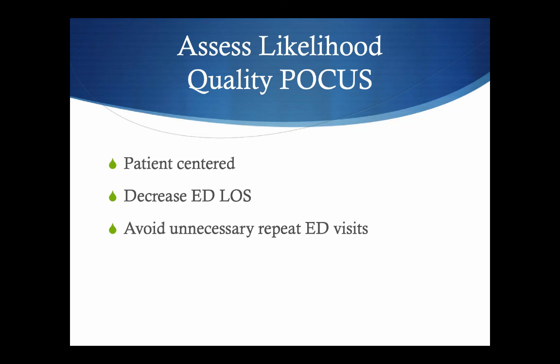And if we do this, I think it's a pretty patient-centered way to get one. We can go in, ultrasound, kick them out. I love these, 5 to 10 minutes, and they're gone. And if we can stop telling them to come back the next day, because that just clogs us up, wastes time. Patients don't like it, and that's all I got.